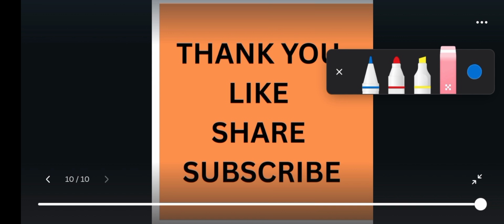We are gradually covering details of image interpretation, and the end, when you put these details together, that is what will form the image interpretation lectures.